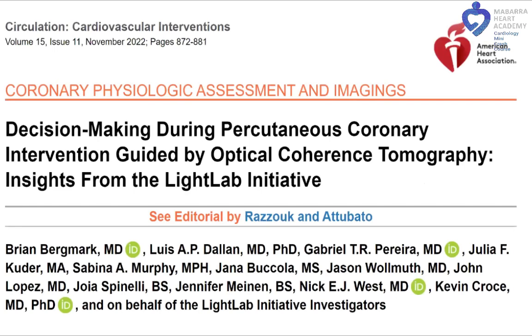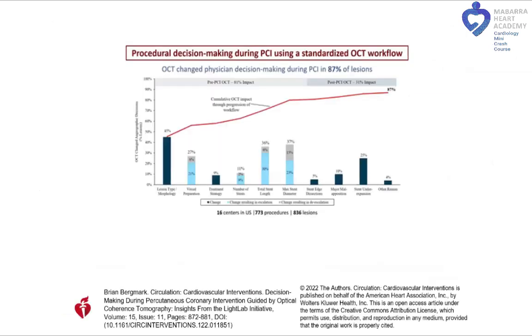So why do we need to use OCT? This was published in November 2022, and they concluded that OCT changes the plan of the interventional cardiologist in up to 86 or 87% of cases. Basically, the decision changes when you use OCT, particularly when you do pre-PCI OCT.